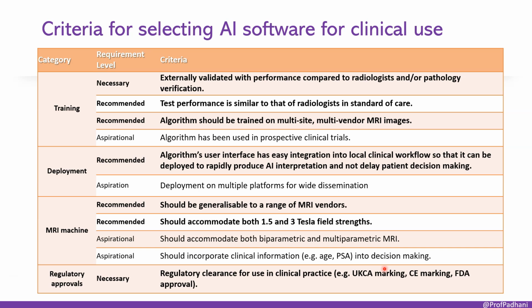Non-negotiables. External validation against radiologists or pathology. You need proof it works. And regulatory clearance, CE mark, FDA approval. Basic safety and efficacy checks. Makes sense. What about recommended criteria?